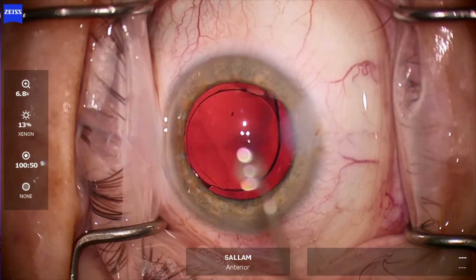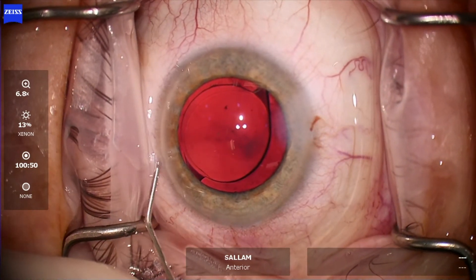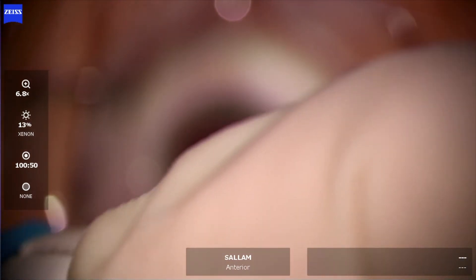And finally wound hydration. I checked the pressure with the Tonopen at the end, so I don't need to see them on the first post-operative day. Thank you so much for watching.